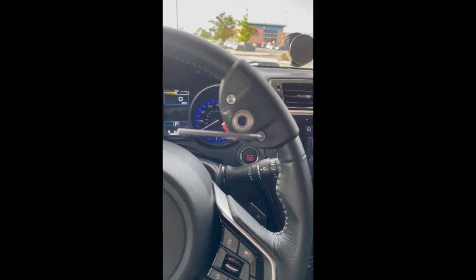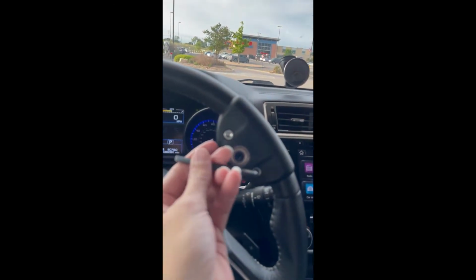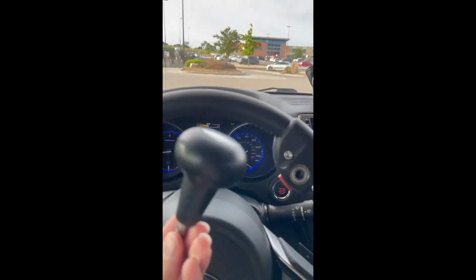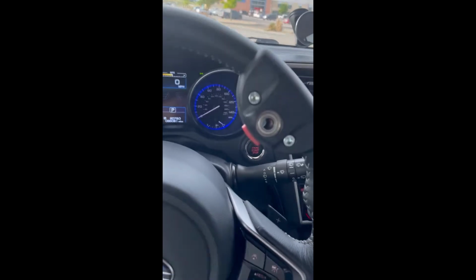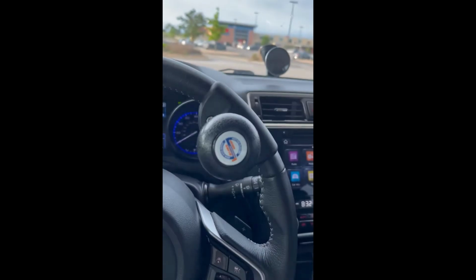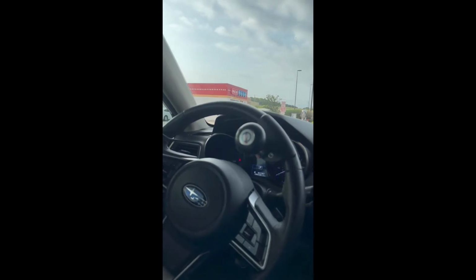All right, so right now I'm putting a spinner knob and attachment on the steering wheel. It's a C-clamp, and everything is done with Allen wrenches. Once we get this all tightened down, we take our spinner knob and put it into place. It's really awesome because the client I'm going to be seeing later today is only able to use the right side, so she's able to take the wheel and spin it using only one hand, and it's a lot more fluid motion, which is pretty amazing.